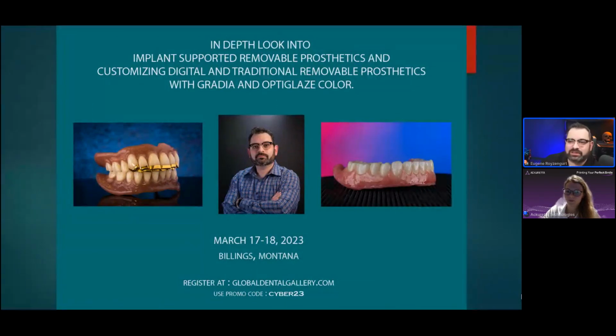Yes, it will definitely do this, but you need to have a certain amount of skill yourself. You need to know the protocols yourself to properly align things. You need to know how to rotate the prints. You need to know where the supports need to be. If you have this huge print with 3 supports, if you get the angle way too wrong and you just got a couple of supports on this huge structure, well, obviously it's going to fail.